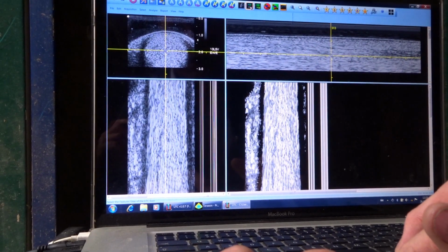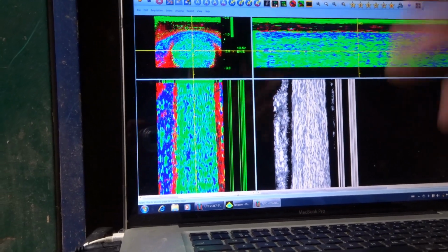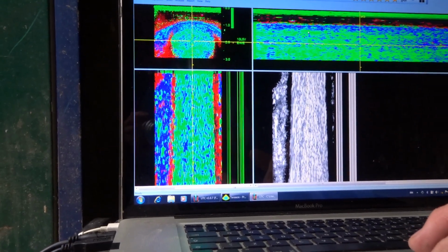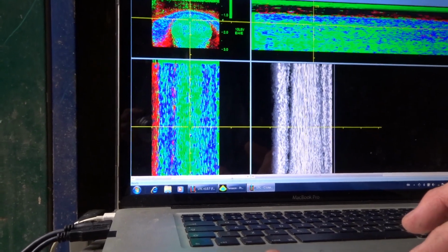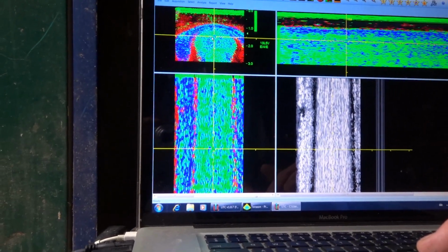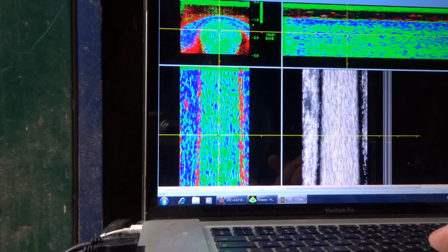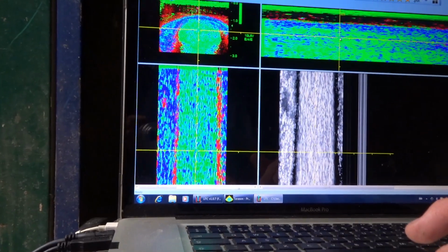Now the next step is that we highlight the different fiber types. The computer has done that for me, it has processed. You can see here the green fiber types, which are healthy, normal. Here we can see the old scar. This horse is a re-injury, so there's too many blue fibers, less elastic tissue. That is acceptable, a horse can race with this.